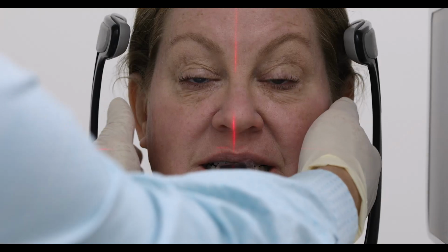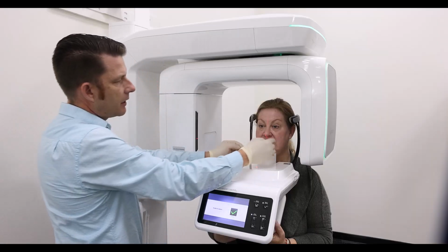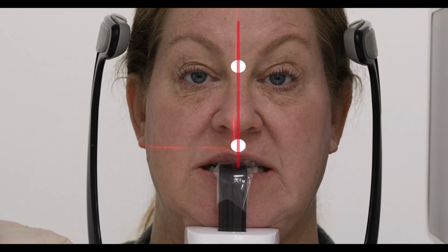I'm going to go ahead and gently open there. We're going to line you up center and close. And I'm looking at two anatomical points right between the eyes and the philtrum just below the nose.